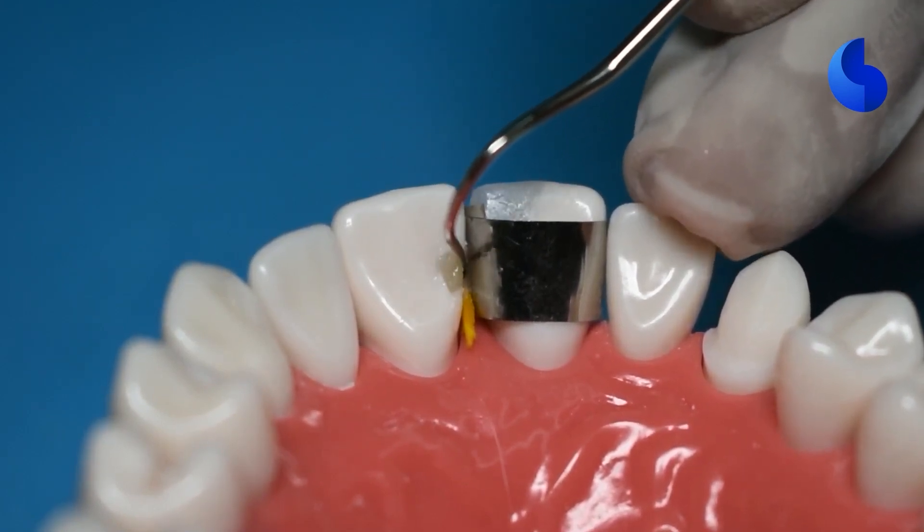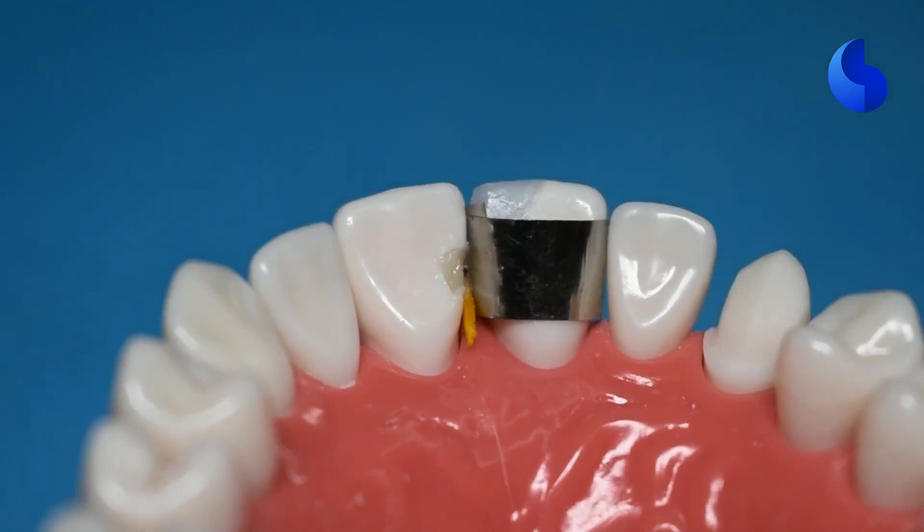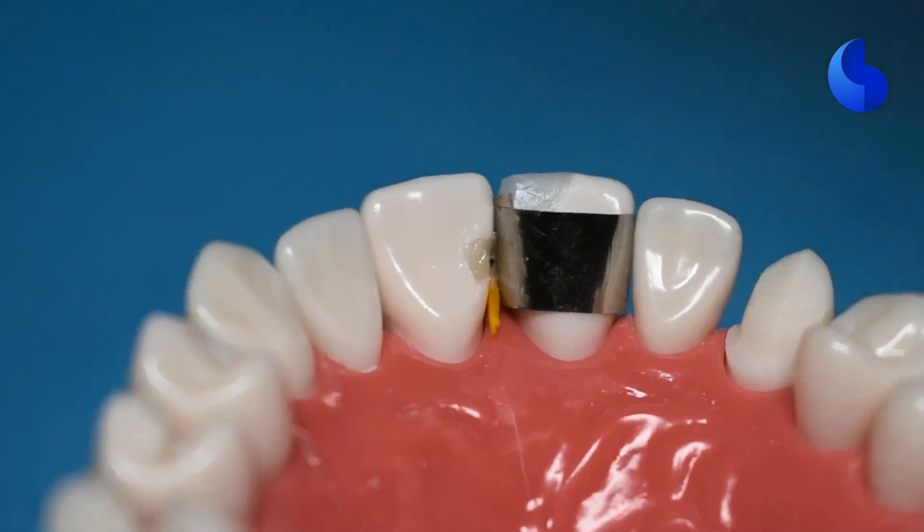As you keep adding composite, you can continue to remove excess so that it makes your job easier towards the end result. And we'll go ahead and cure our first layer.